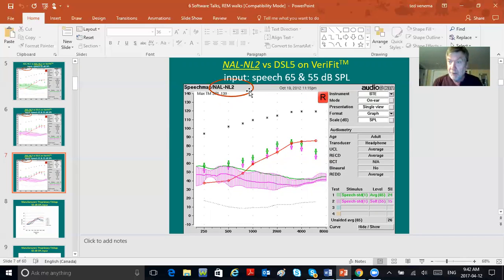He didn't have real ear, so he couldn't see the results of his endeavors. Now we can see the results.